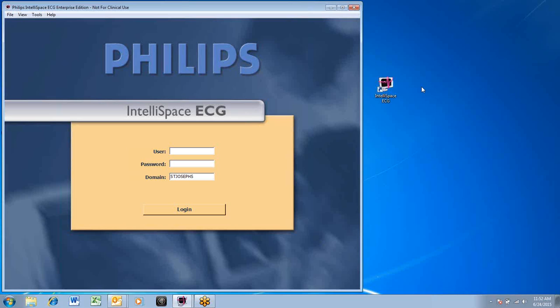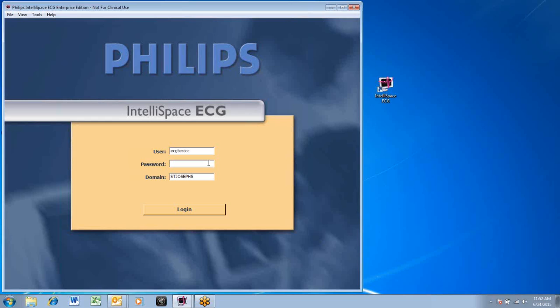The IECG icon can be found on your desktop. The first screen you will encounter is the login screen. You can obtain access to the application by contacting St. Joseph's Computer Room at ext. 33040.